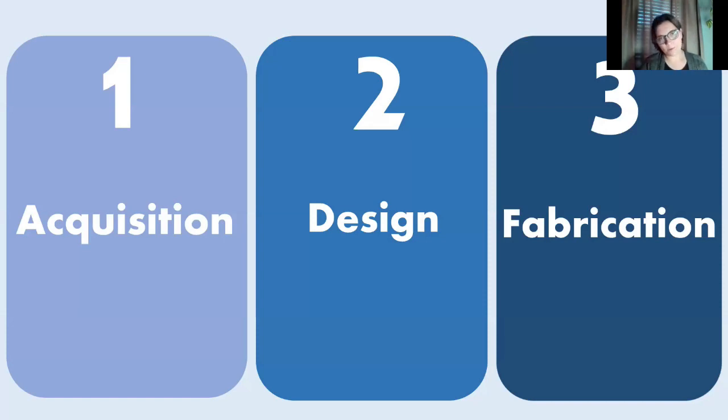So this is the CAD part of CAD-CAM. CAD-CAM is computer-aided design, computer-aided manufacturing, and that CAD part is step 2, which is the design. Once you've designed whatever you want to fabricate, you roll into step 3, which is the CAM part of CAD-CAM, computer-aided manufacturing, and that's where you start to create the smiles that you've designed.